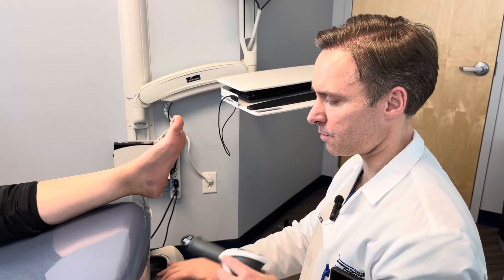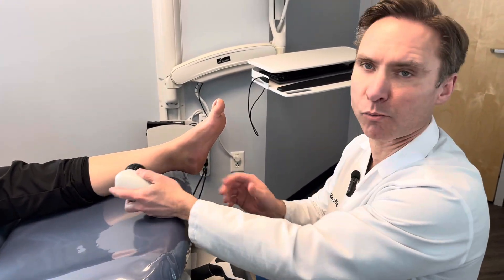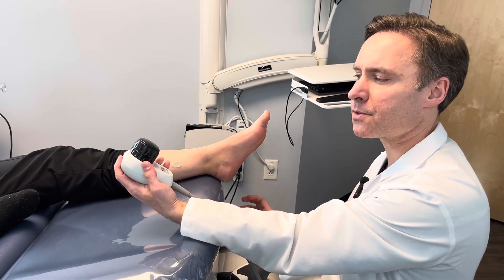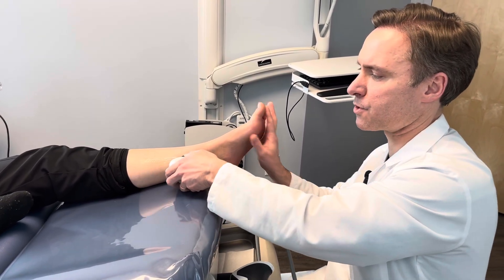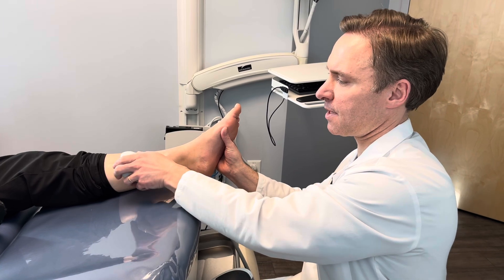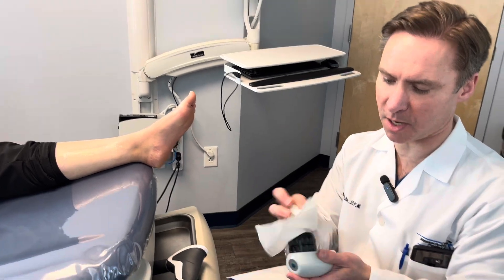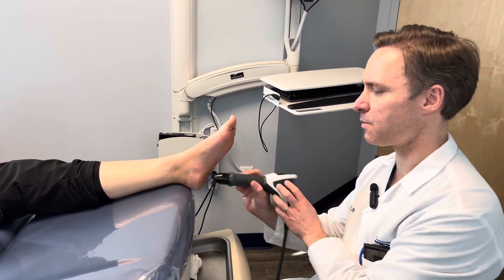There are a couple of ways you can do this. You can use something called the V-actor, which you can use on the back of the calf. It's very similar to foam rolling. What I'll do is start on the back of the calf — it turns on and off by itself after about a minute. You can spend time on any soft tissue that's very tight, such as the posterior tibial tendon or the Achilles tendon. Then wipe it off with paper towels, and you can also take it down to the bottom of the heel.